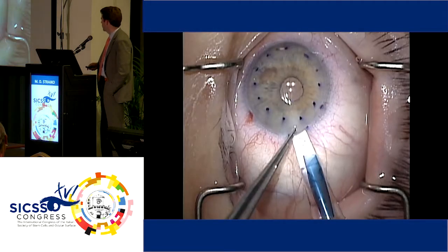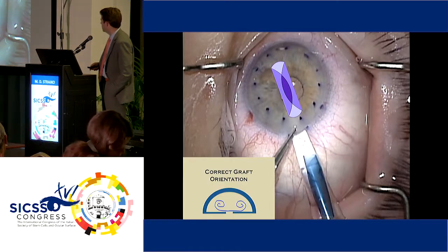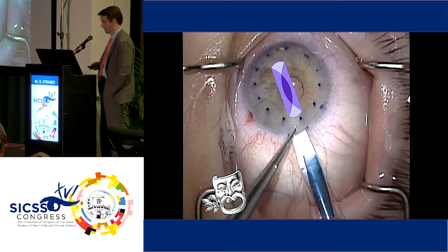So what that looks like in the tube, if that's the graft, you want the V shape on top, and when you inject, you'll have the correct graft orientation and you'll avoid tragedy.